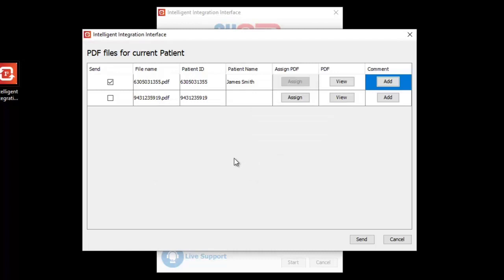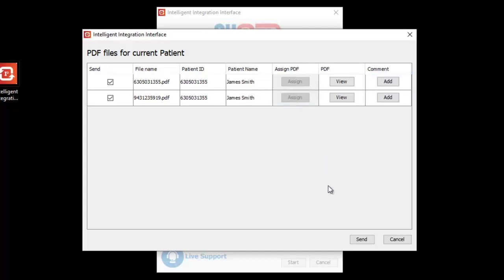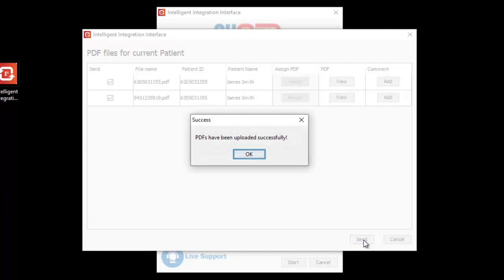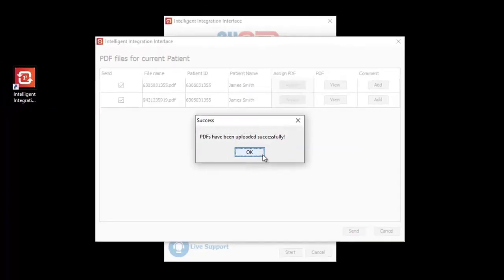If an ECG is not automatically ticked to send, but you are certain it was intended for the currently selected patient, click the Assign button to manually assign the ECG to the current patient. To send all the selected ECGs to the currently selected patient, click the Send button. A confirmation of filing will be displayed. Click OK to close the software.